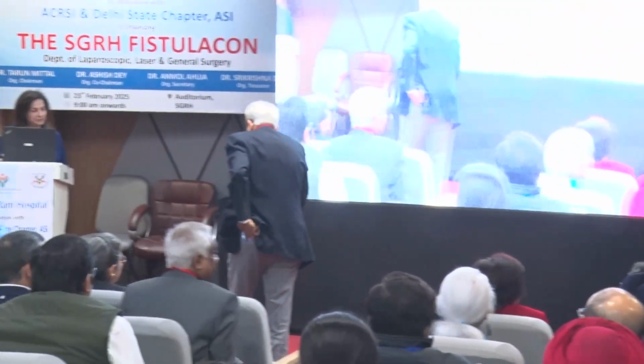Can I? Yes, please. No, this is a very important thing. As per, do all fistulas need MRI?